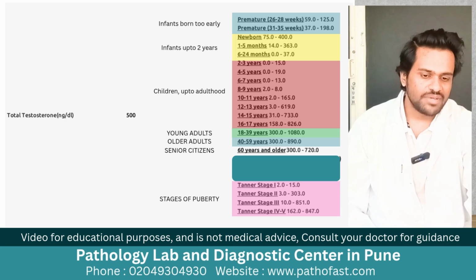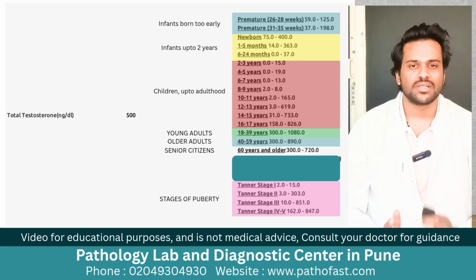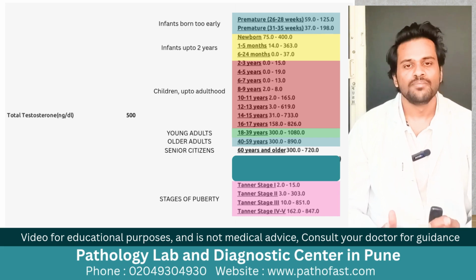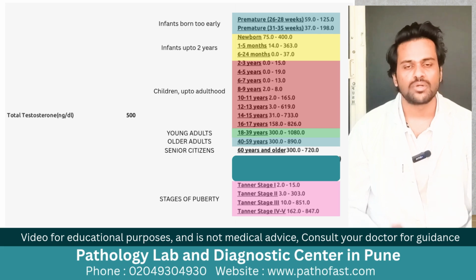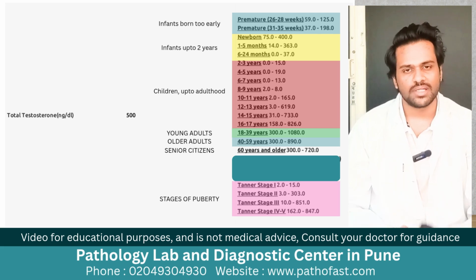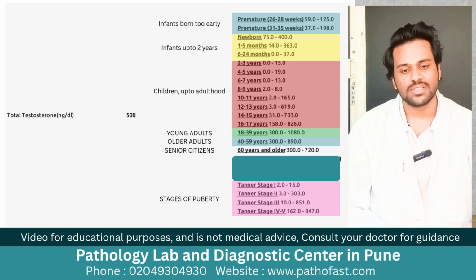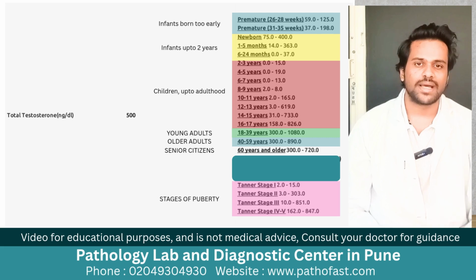And right at the bottom we have something called the Tanner stages. These Tanner stages are only something that doctors will usually refer to. You don't need to look at this yourself if you're a patient. These are different stages of puberty which only doctors know about. Doctors know what changes should take place in a person's body when that person is attaining puberty and at what stage. And there are testosterone levels for every stage of this puberty, which are called Tanner stages.